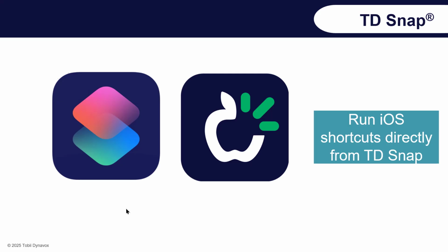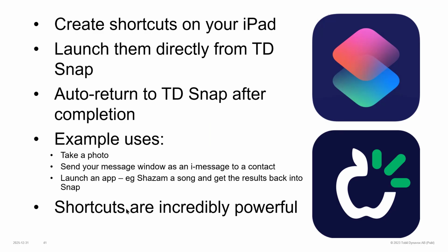Another recent update is the ability to run iOS shortcuts directly from within TD Snap. iOS shortcuts on the iPad are really exciting and powerful. They're a way of combining lots of taps or actions that you might do repeatedly into one button, and that can take a lot of steps out of a particular task.